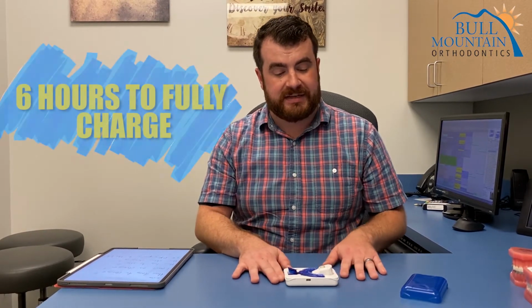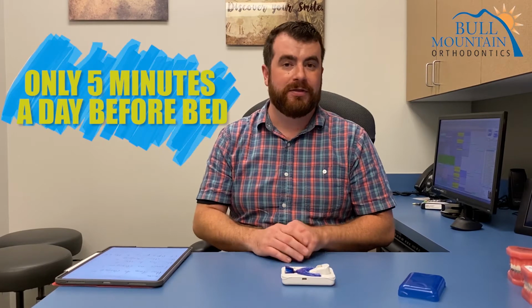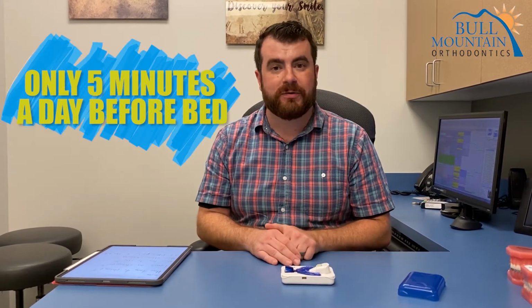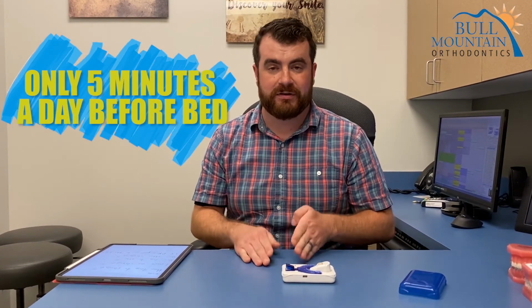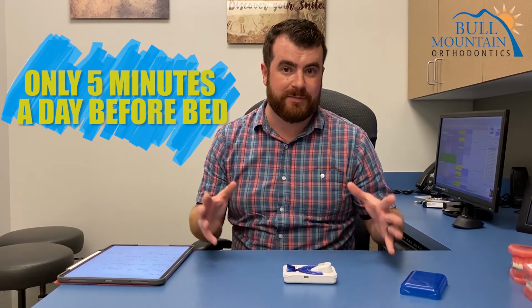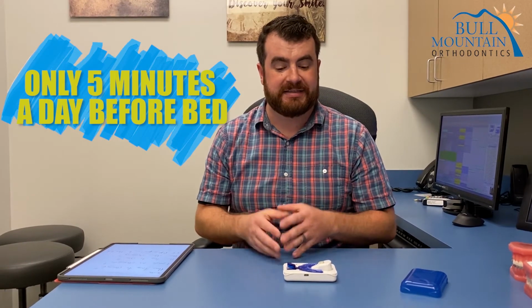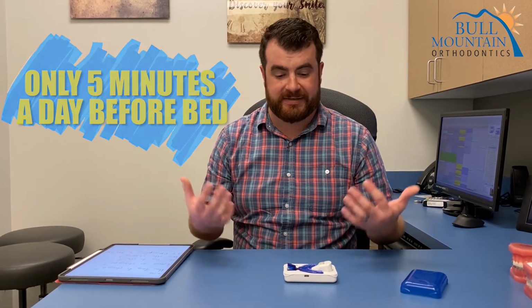It does take about 6 hours to get a full charge, but once you're using it, you only need to use it 5 minutes a day at the minimum with your aligners in. We most recommend that you use it 5 minutes a day with your aligners in right before going to bed, so that you have your aligners in for the maximum amount of time. So let this take care, use the mechanics it does to get the aligners to move as best as possible.